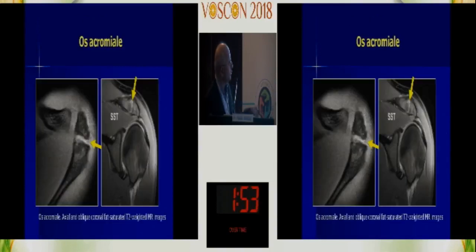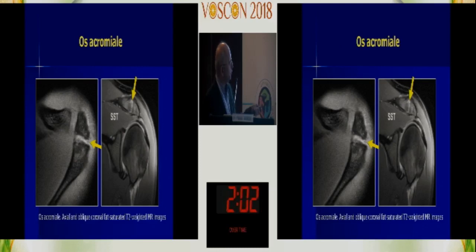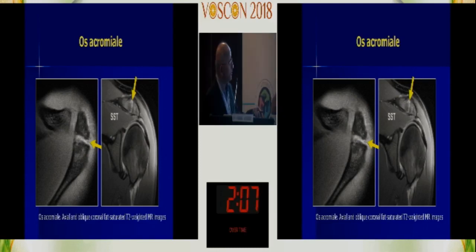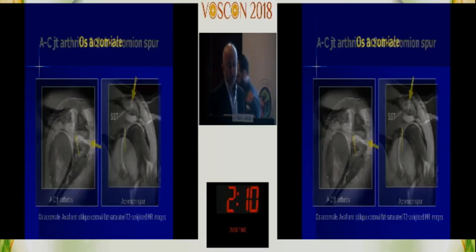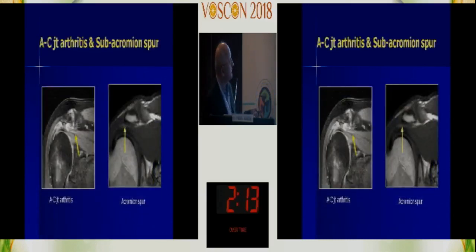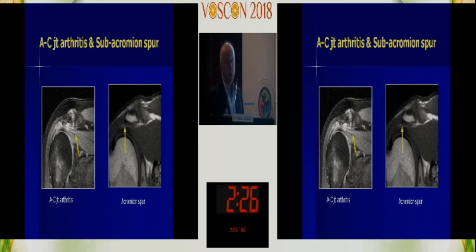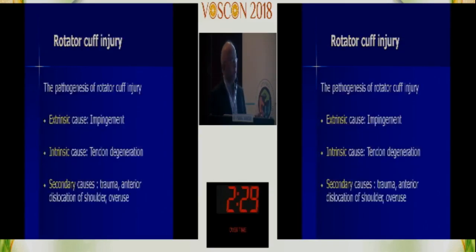The os acromiale can be confusing — from the top view it looks almost like an AC joint itself. Only about 15% of patients have it. The top view shows a pseudo-cartilage formation, and you'll actually miss it on the AP coronal view. If you suspect an os acromiale, look at the top views. For AC joint arthritis and spurring: a fuzzy enlarged AC joint, a small spur below, lots of fluid below the acromion, and a tendon getting pinched — this is impingement, the most common diagnosis you'll see on an OPD basis.